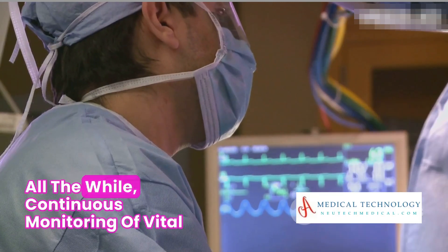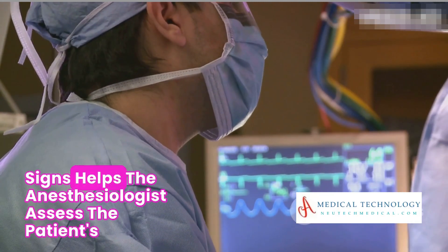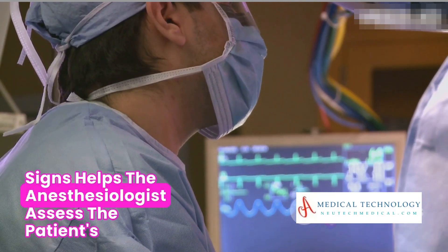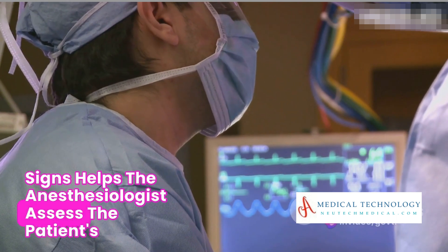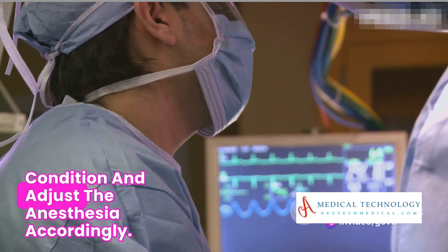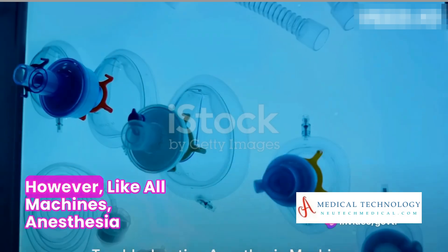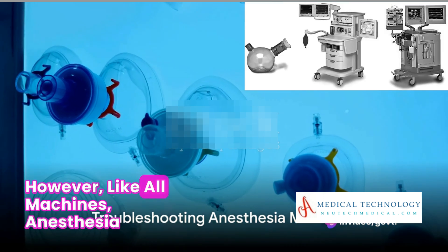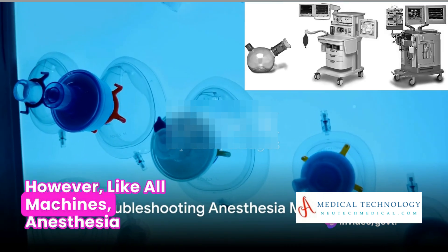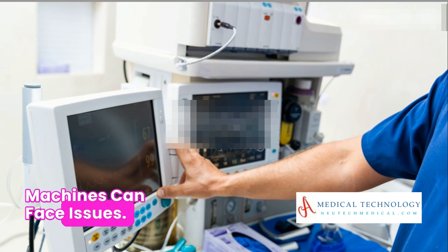All the while, continuous monitoring of vital signs helps the anesthesiologist assess the patient's condition and adjust the anesthesia accordingly. However, like all machines, anesthesia machines can face issues. This is where troubleshooting comes in.